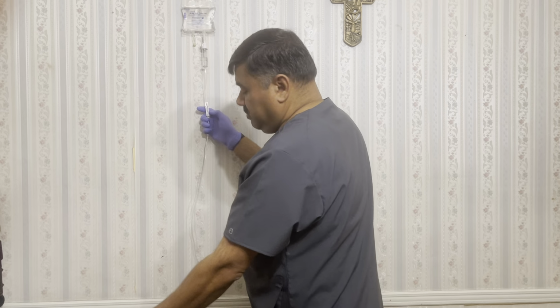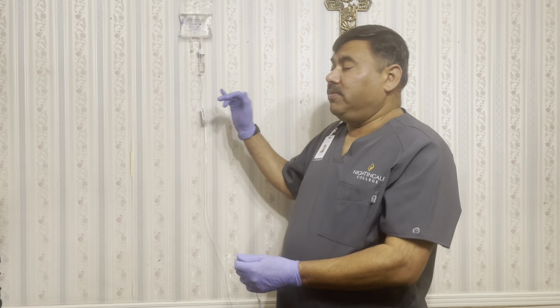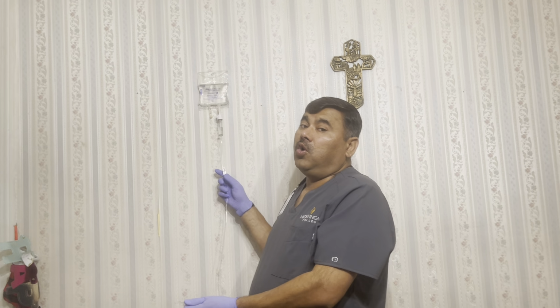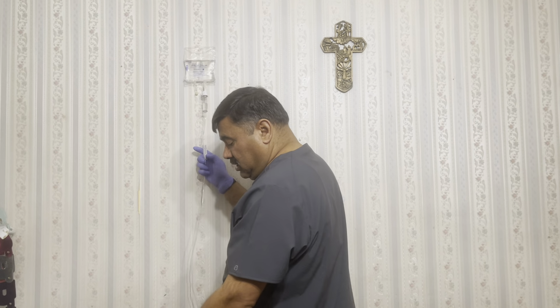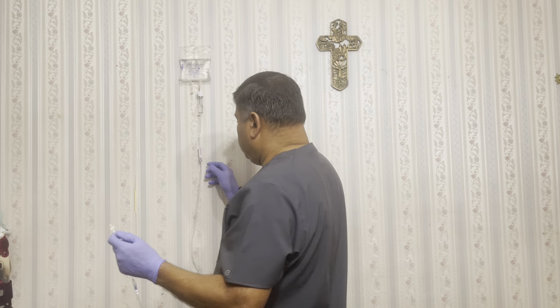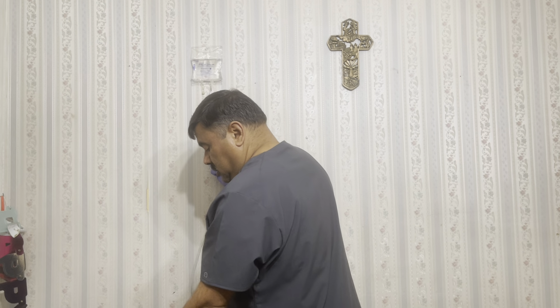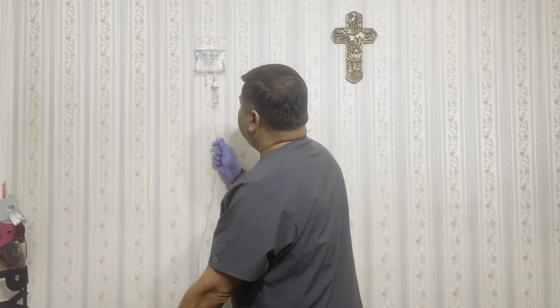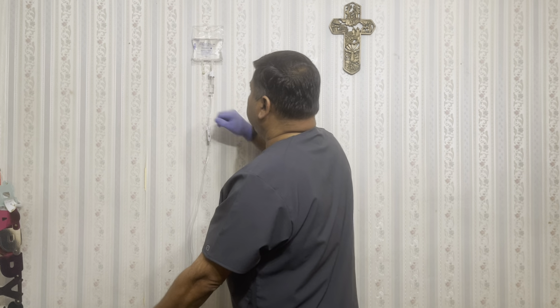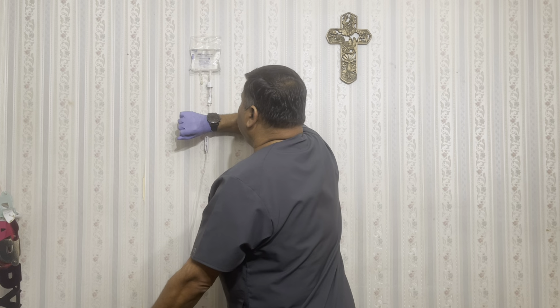My tube is primed, so now I'll count how many drops I was supposed to give. That was 38 drops per minute. So I'll be counting 38 drops, and from now I'll count for a whole 1 minute. So I'm opening up again. I had taken off the adapter's cap. As I said, I'm going slowly, because I have to count 38 drops, so I'll be counting a whole 1 minute.